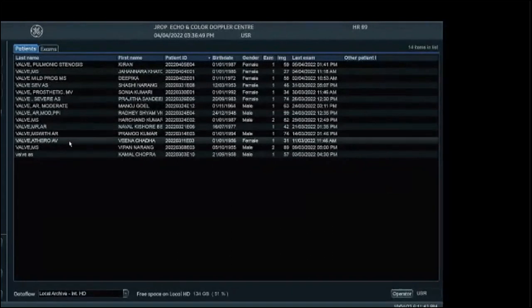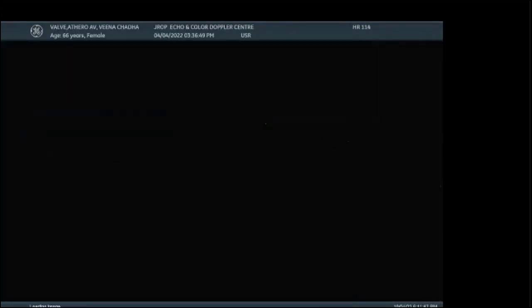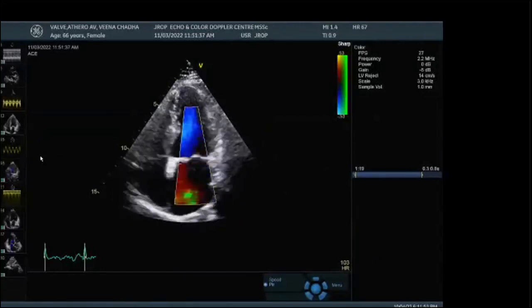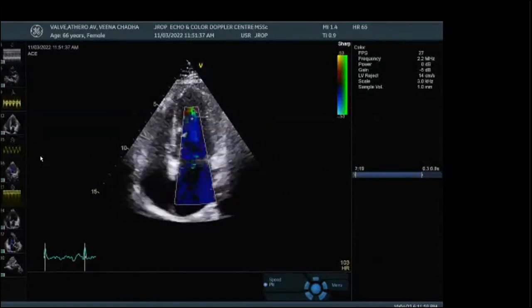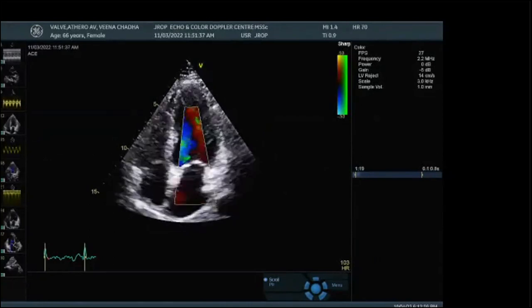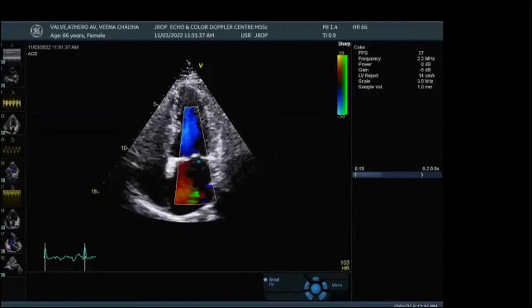Just give me a second. I'm showing you your MSMR on the screen. This is a patient who has MS and MR together. It's atherosclerotic, nothing significant. Can you see this red button, this cursor over here? Yes, sir. I'm going to scroll this cursor. Initially, systole, so all the MR blood would be there in systole.